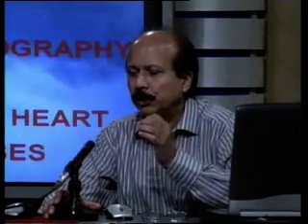Should all aortic valve disease patients be subjected to transesophageal echo? No, not really. They don't have to be. I just showed you that transthoracic example to make the point that if there is a discrepancy in the continuity equation or the pressure gradient, and you want to planimeter the aortic valve, then planimetry of the aortic valve with accuracy can be done by transesophageal echocardiography.